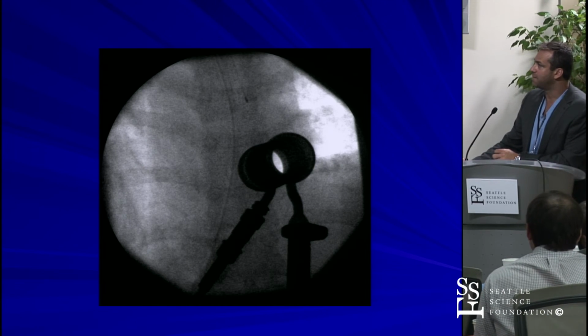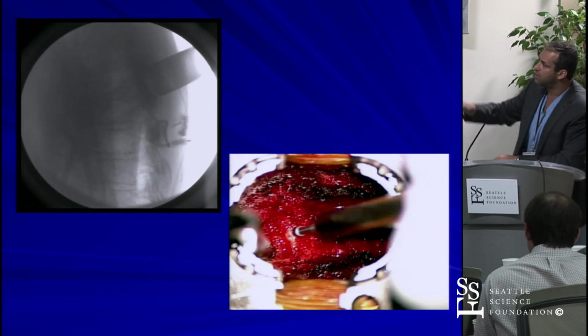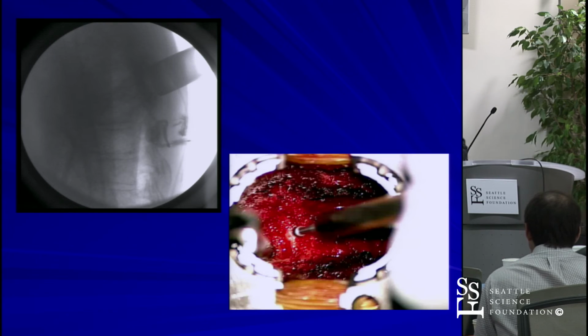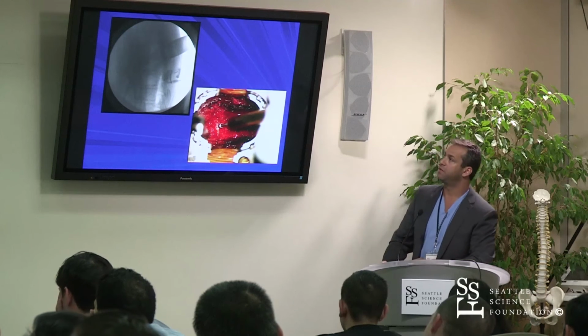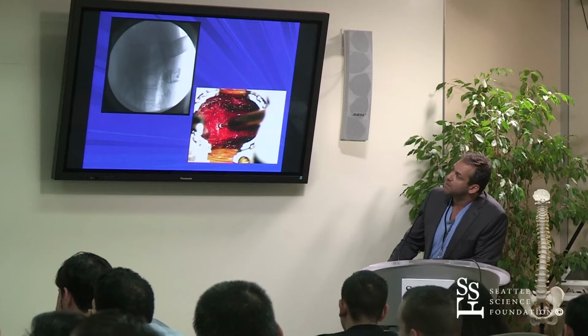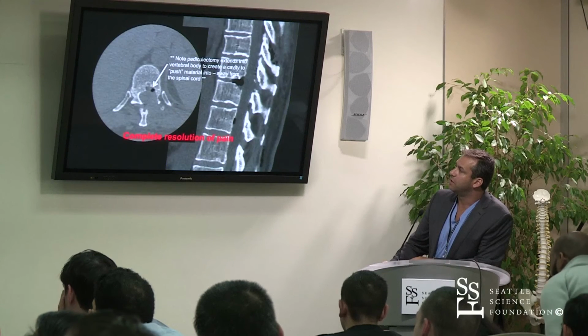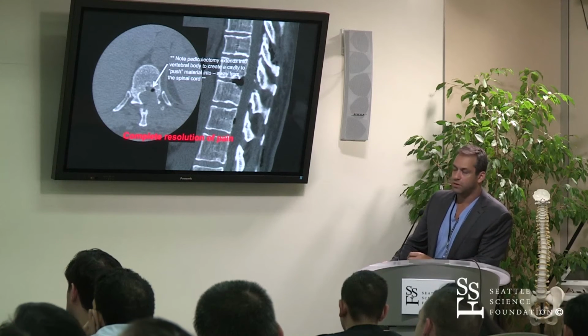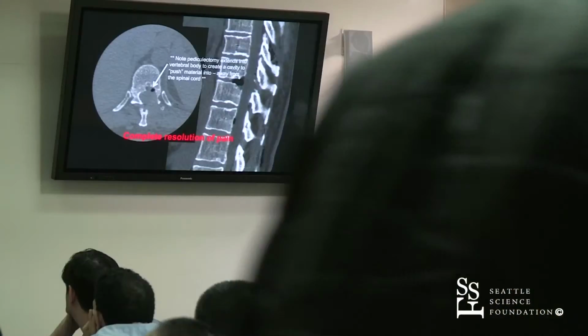And we dropped a tube down. Again, I wish you could see the videos here, but you can see where our retractor is, dropping down, sitting on top at the superior aspect of the lamina at the level below, drilled off the lamina. But what's important to note, and what you would see in this video, is that you don't just drill down the pedicle, right? But you actually drill into the dorsal aspect of the vertebral body.